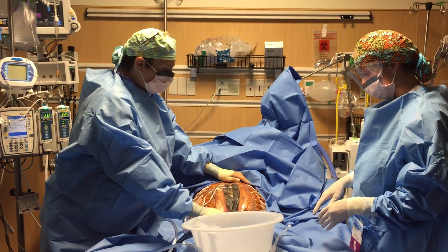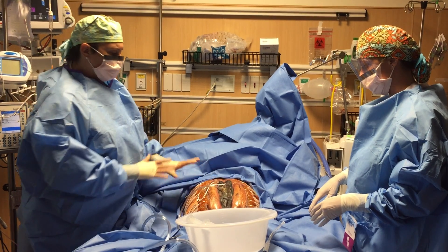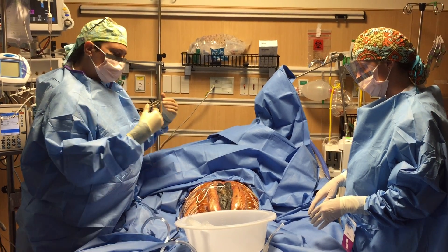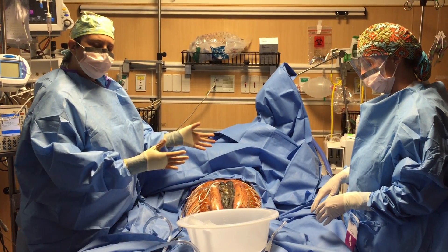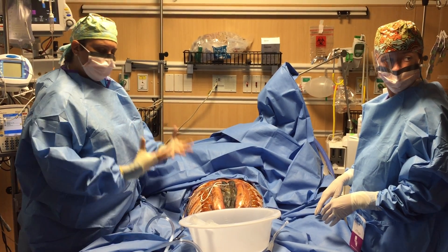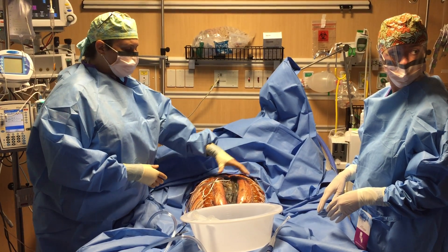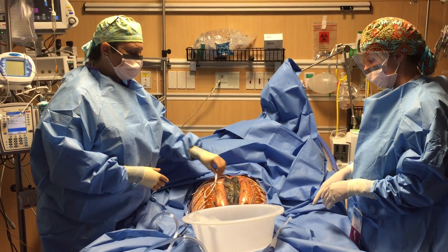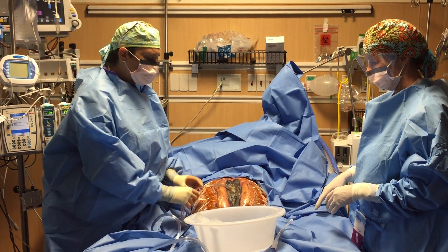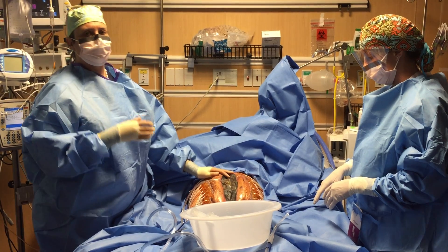What we have here is our patient with an abradynamic fascial closure system on. What I want to talk about is the actual 48-hour wound vac exchange — not doing anything exciting today, other than daily and every-other-day care. What we want to talk about is the way we have it set up, and also these elastomers — we're going to look at possibly adjusting them if appropriate.